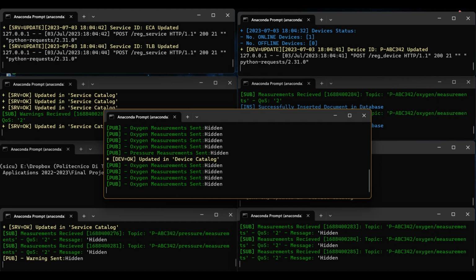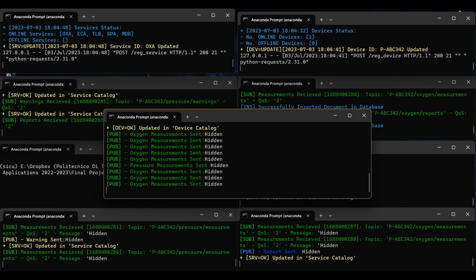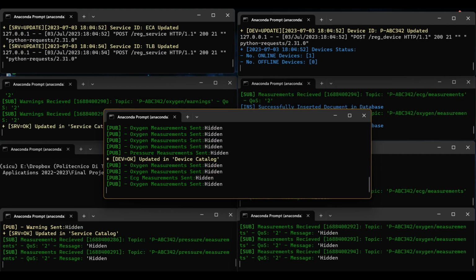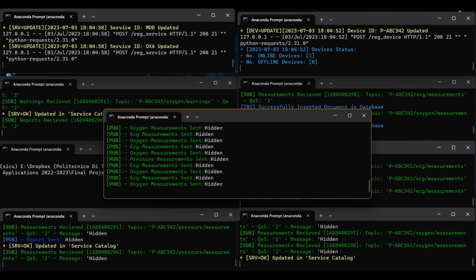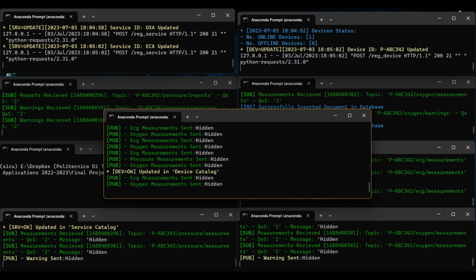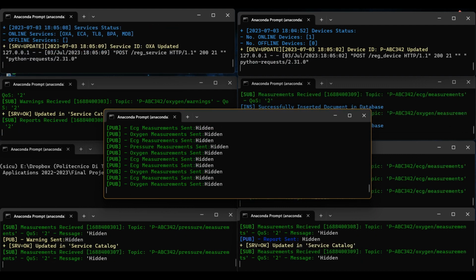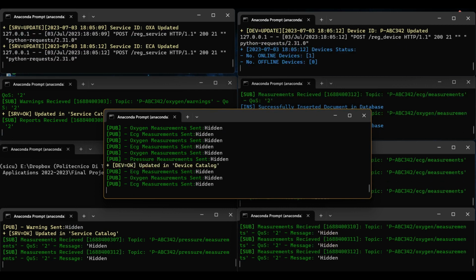I should note that this gateway device includes 3 different sensors, including the electrocardiogram, the blood pressure cuff, and also the pulse oximeter, that it just gets the measurements from the patient in a real-time manner, and also it sends the measurements into different microservices that have been previously defined for the Raspberry Pi in order to send.